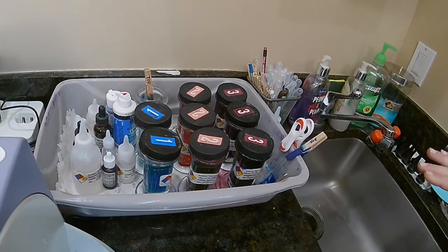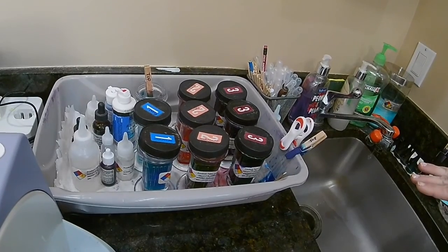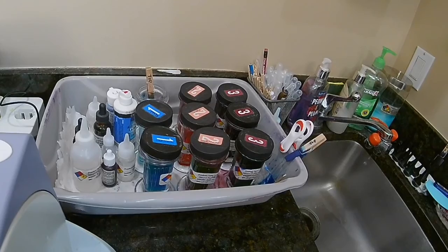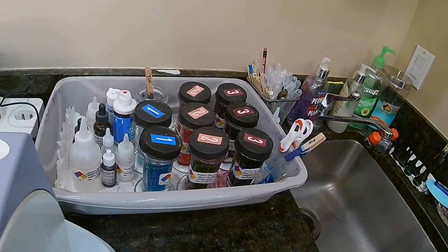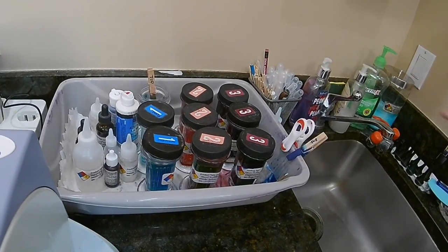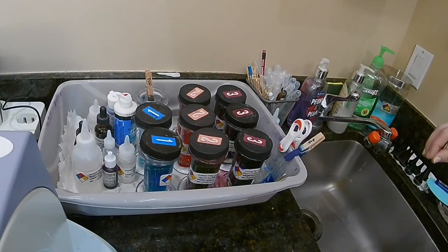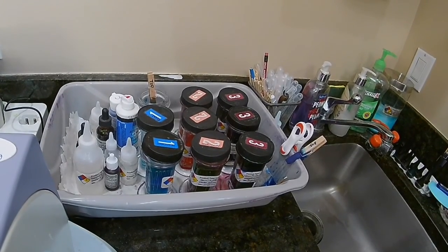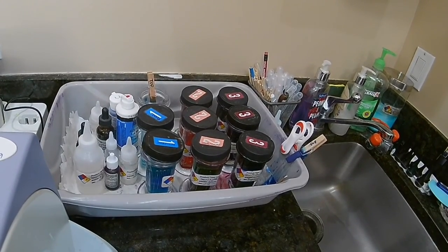Also, prior to me doing this, I had let my slide dry. I did want my slide to dry completely before putting it in the fix, just so that the cells wouldn't come off of the slide. And then this is adhering it before we're staining. So a little different. A few more seconds here.